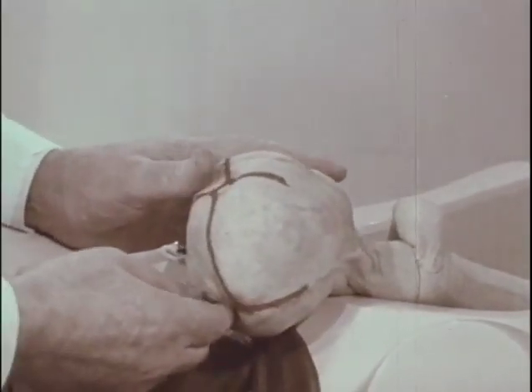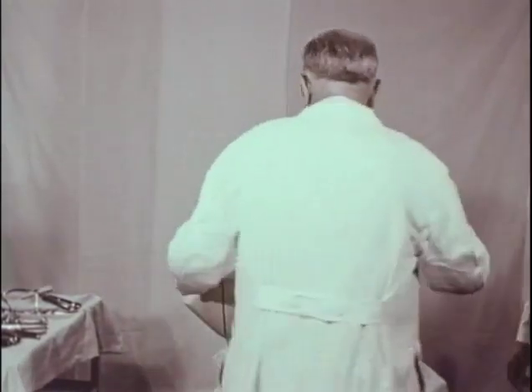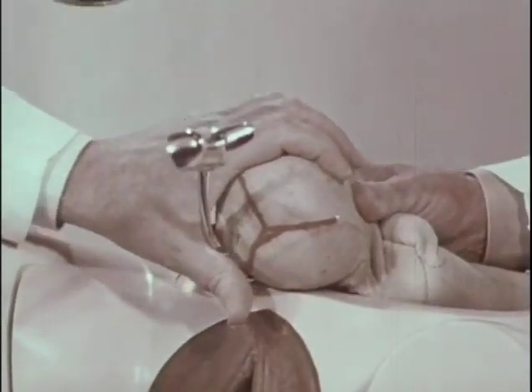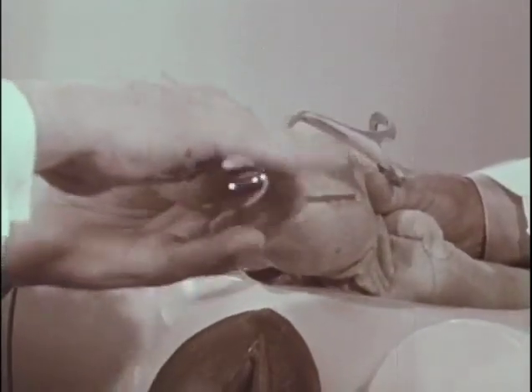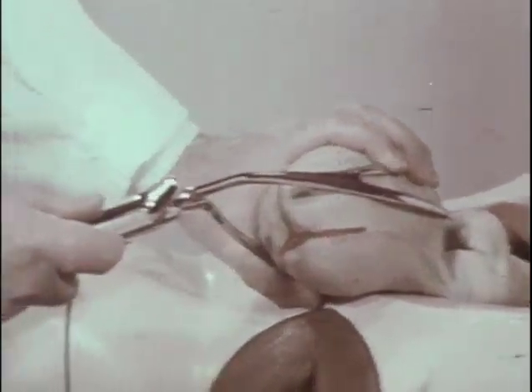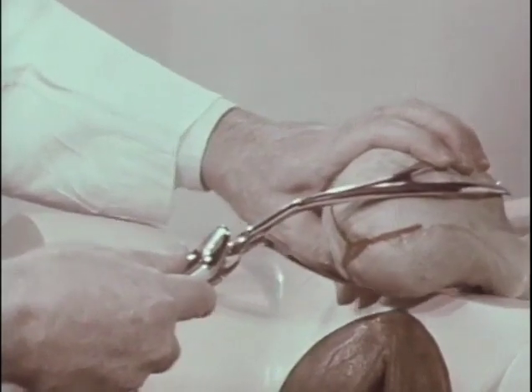And we have the LOP, and we'll consider it to be, for the first step, an ROA, and we'll apply the right blade first. Posteriorly, and it's the right blade to the left ear in this occiput posterior position, and the left blade to the right ear, crossing our handles in order to lock them. And our posterior fontanelle is a finger's breadth below the plane of the shanks this time, since the occiput is posterior. And in the key and lock maneuver, one pushes up slightly, rotates over a small arc, and pulls down.